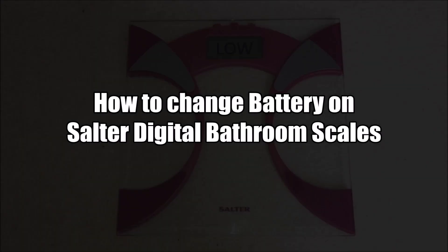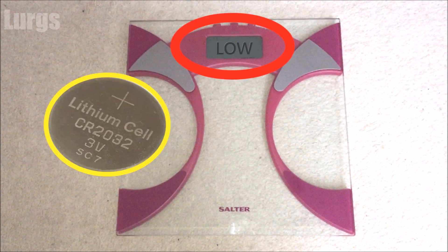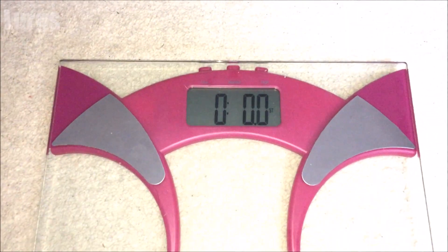How to change the battery on your Salter digital bathroom scales. If you've got the display on your scales which says low, you need to change the battery — don't worry, you need a CR2032 battery.